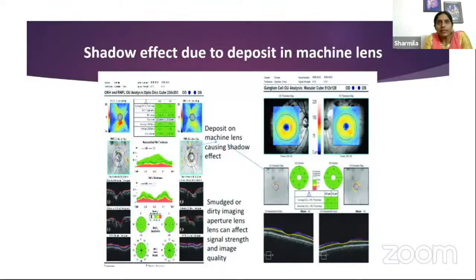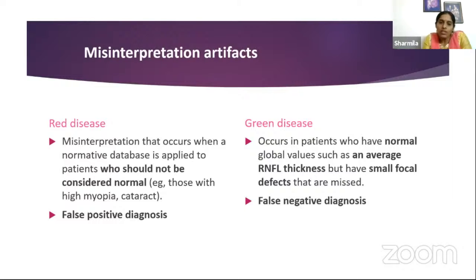There may be also certain deposits on the lenses because of touching of the lens, which may be seen as media opacities. So one has to clean the lens before taking the measurements. The most important thing here is misinterpretation artifacts.